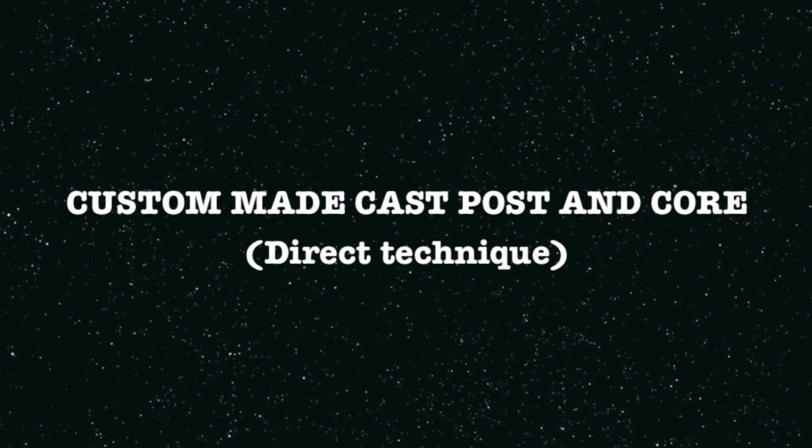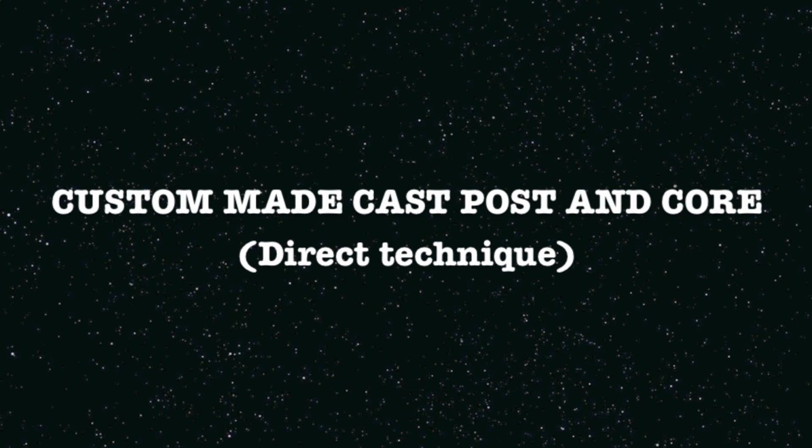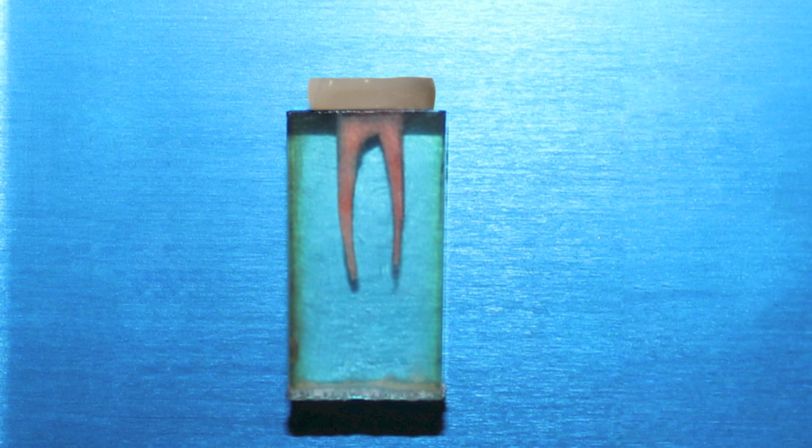Bismillah ar-Rahman ar-Rahim. In this video, we will demonstrate the direct technique for fabricating a custom-made cast post and core. For the aim of demonstration, we will use an endo-treated maxillary premolar which was cut leaving only 2 mm to mimic a damaged tooth.